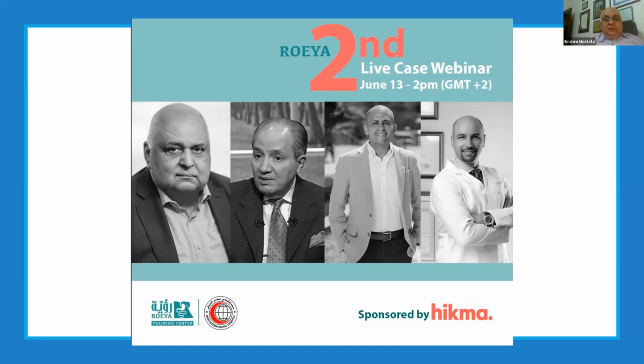The next question is: how long can you keep the metallic stent, and what did you use to prove it is out with the instrument? How long do you keep it? For benign stricture, not more than 3 months, but Hani left it 9 months. Sometimes if the stricture recurs, you can leave it for a long time.